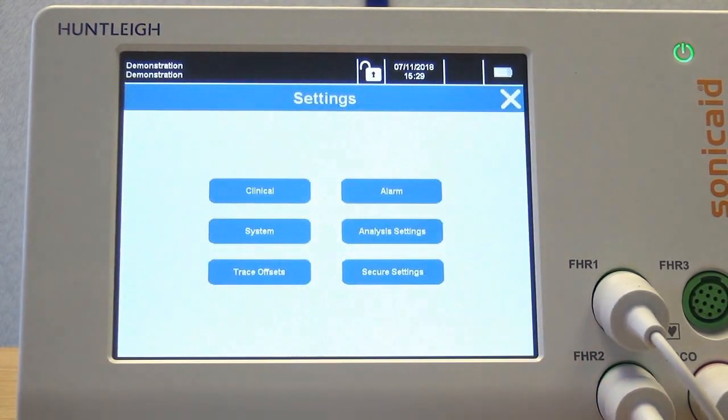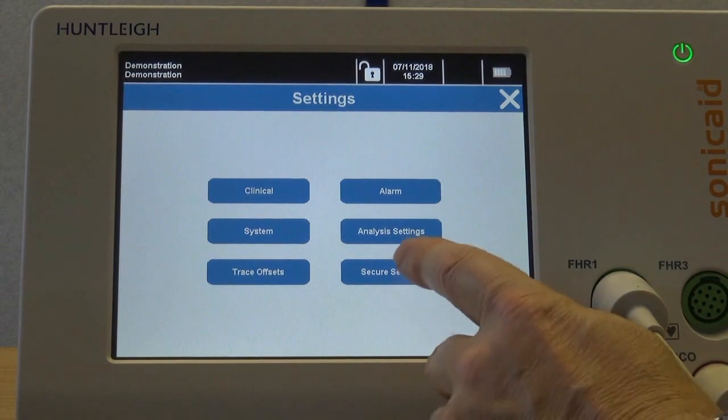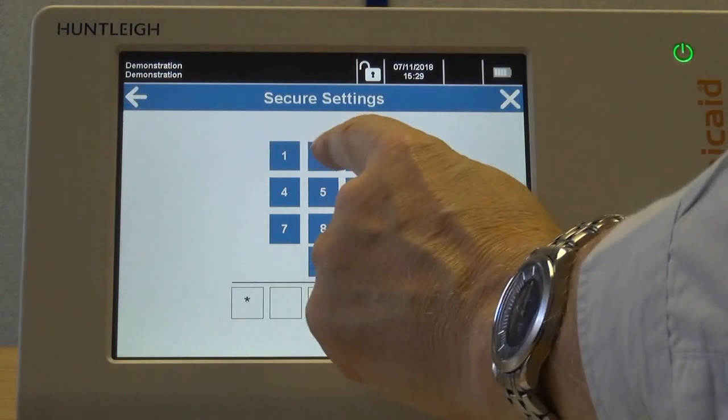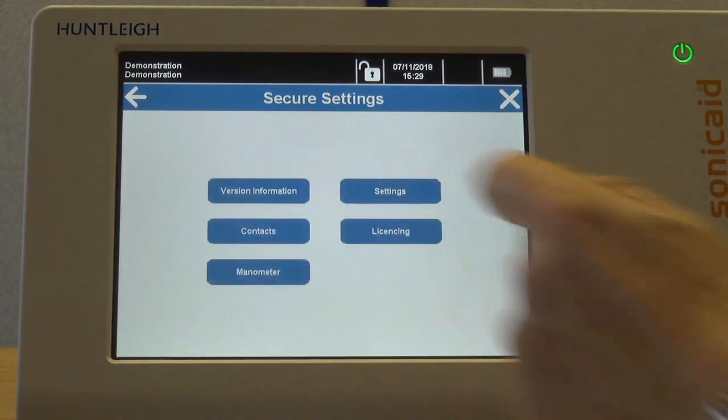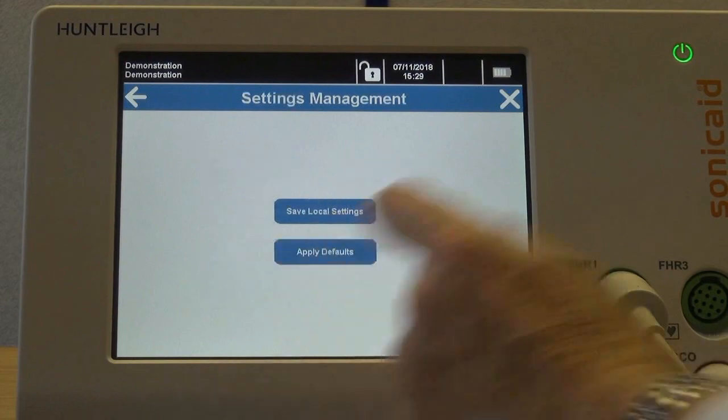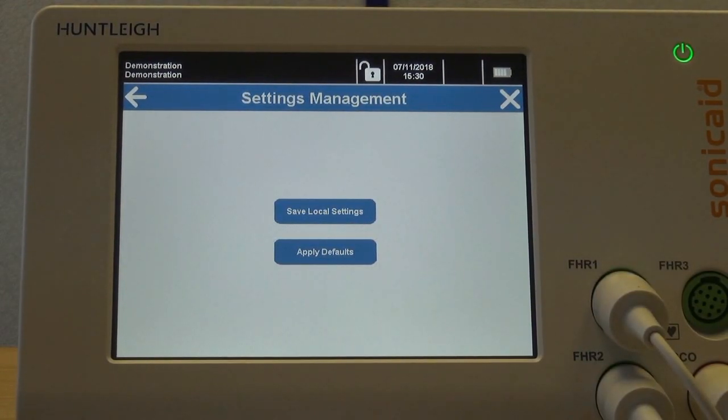Enter the settings screen, select secure settings, and enter the PIN code. Then select settings followed by settings management. Select 'save local settings' to save them as the new default settings. To restore the factory default settings, select 'apply defaults'.